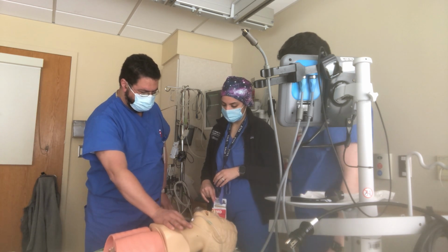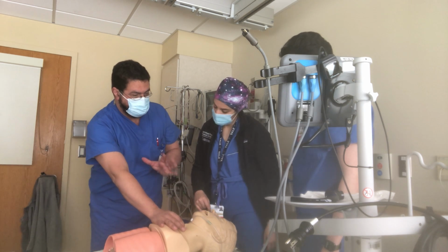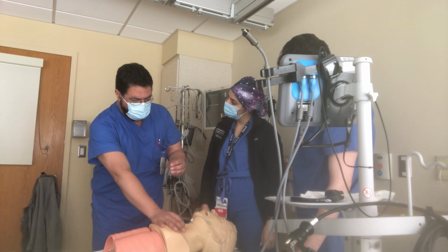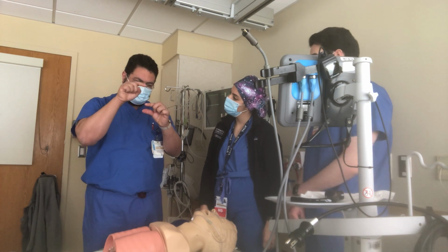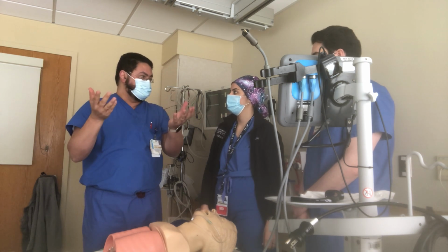And then you do what? You spread. Okay. Look at the dimple here. I dimpled the skin. The reason I'm dimpling the skin is that the skin has to be very close to the cricothyroid membrane, because if it's not, you can fit the trach in between, and that's called false trach, and that's what everybody's scared of.